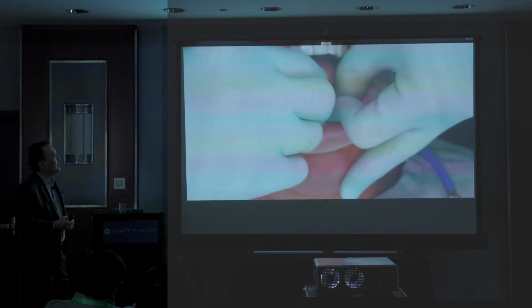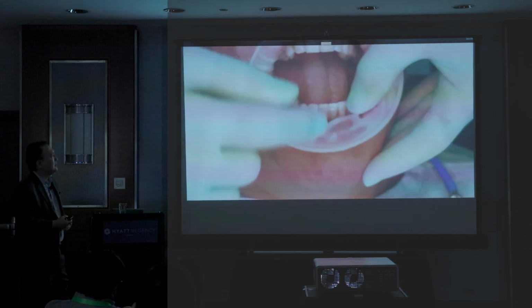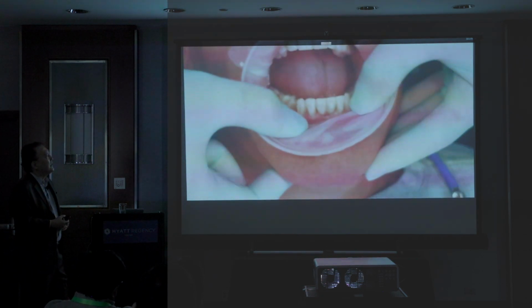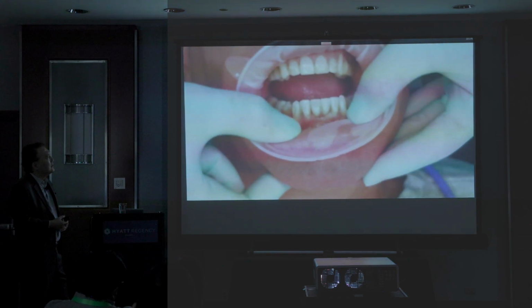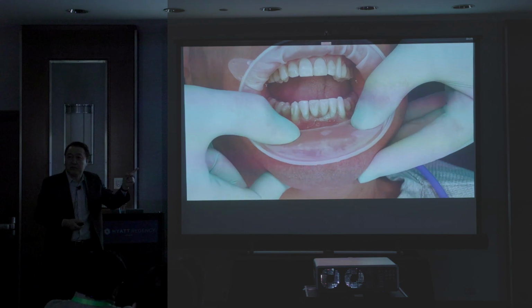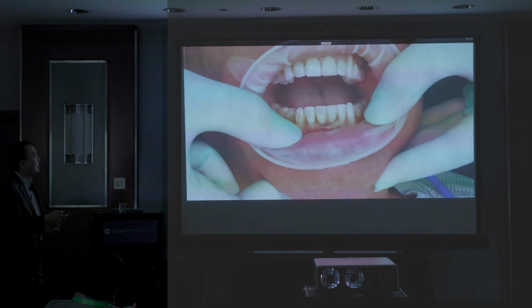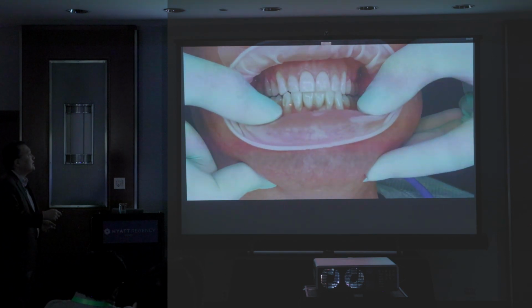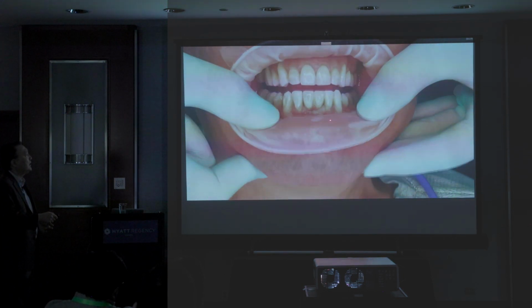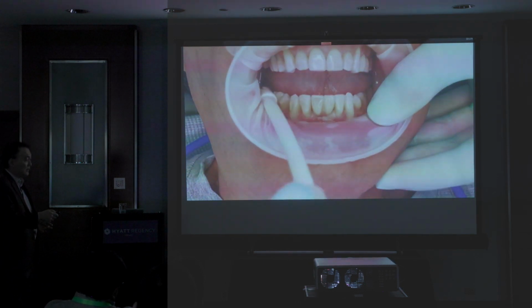So the patient talks to them, they talk to me, and then we had a little miscommunication between the contour and shape, whatever. But that one is the immediate shot. Not bad, right? Okay. I imitated the Jason tools. It's shorter. The pink is pushy here now. The color is different than I expected.